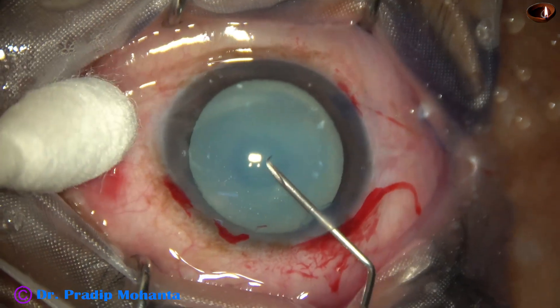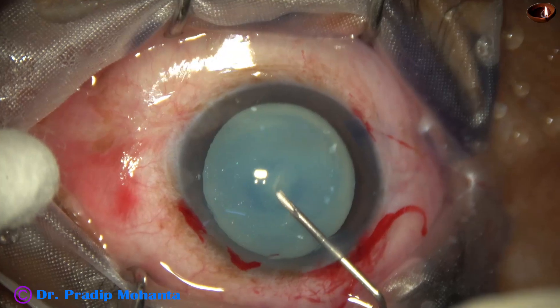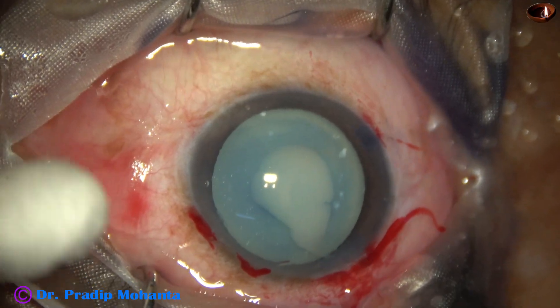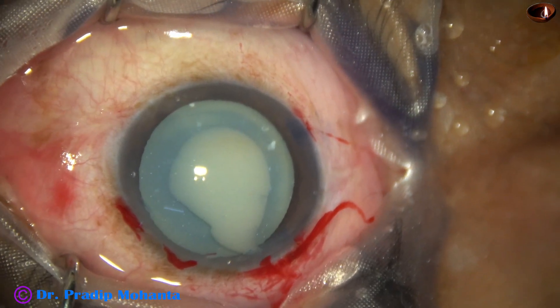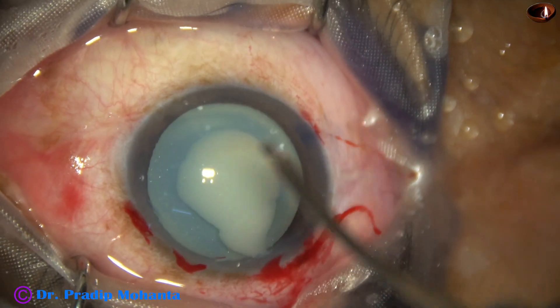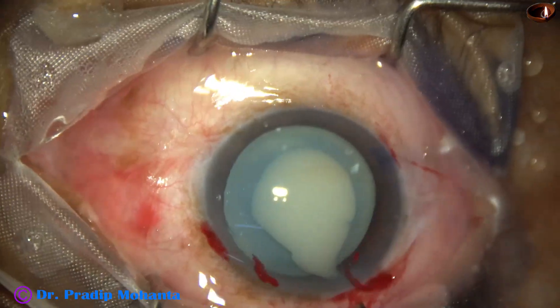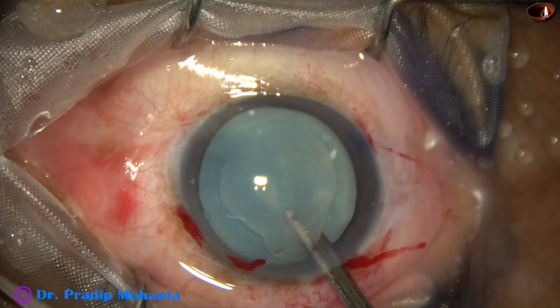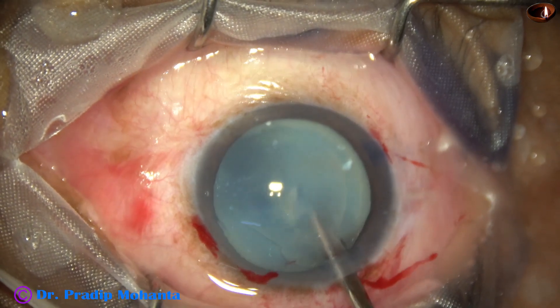After making the main incisions, I make a puncture on the anterior capsule with a 26-gauge bent needle. In this case, I have used Hyalucote, which is a combination of sodium hyaluronate and chondroitin sulphate. As soon as I make a puncture at the center of the anterior capsule, milky fluid comes out.